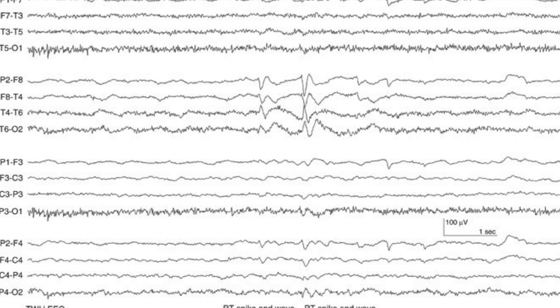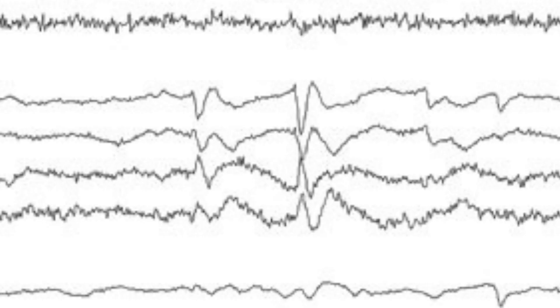This is another EEG with anterior-posterior bipolar montages. The background waves are the alpha waves, and these sharp waves clearly stand out from the background — a characteristic of epileptiform discharge. In this EEG, you can see a typical case of focal interictal spikes with waves. All the sharp waves are followed by the after-coming slow waves. They clearly disturb the background and also form a sensible electrical field of the brain.